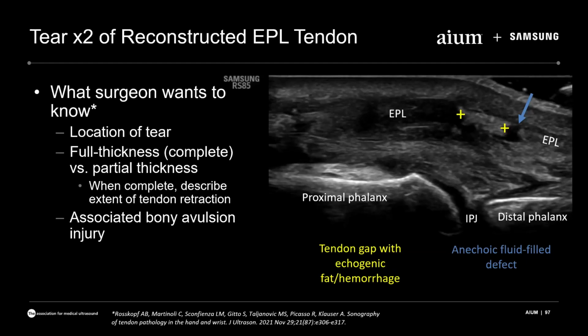Was there an avulsion injury, which we can usually see quite well with ultrasound. And with these cases, I strongly recommend you read the op note. It will save you a lot of pain and frustration rather than just trying to sort this out with no history.